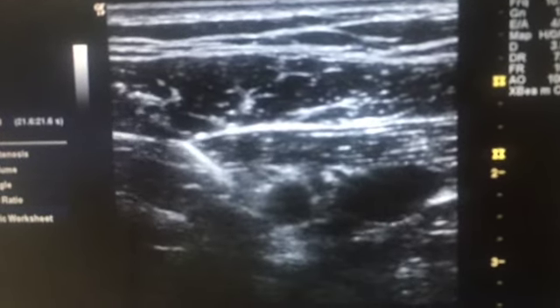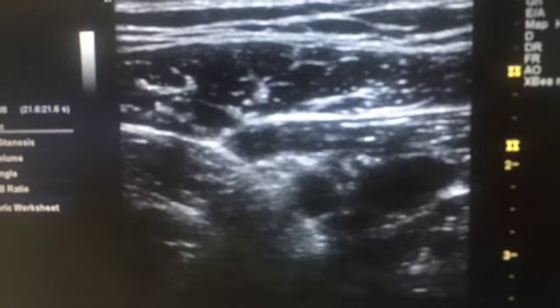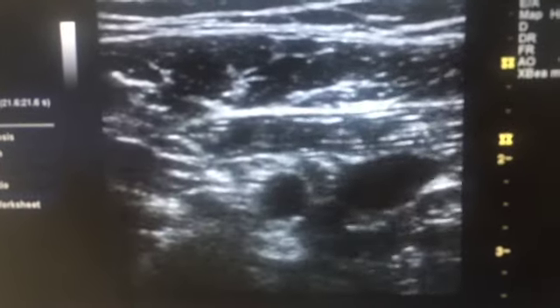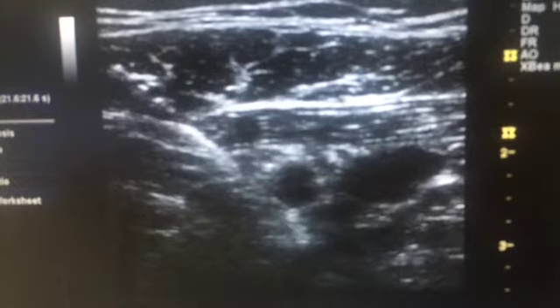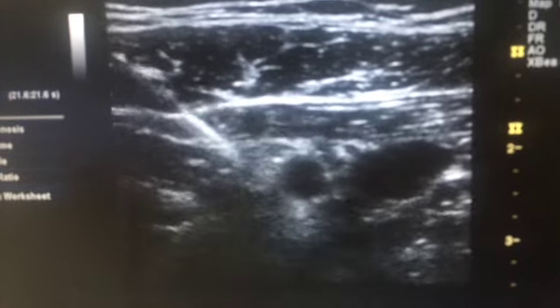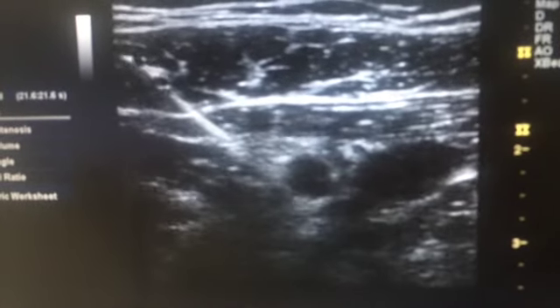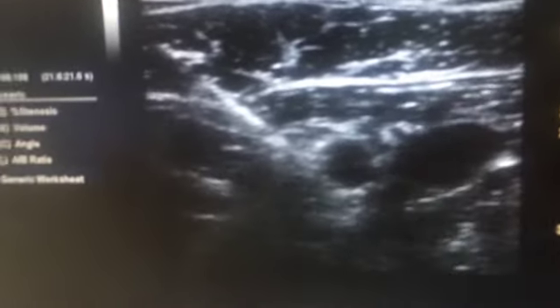My needle is coming from lateral to medial side — you can see the needle. I am going behind and targeting the posterior cord. I have added the PNS machine as well; you can see the response here.